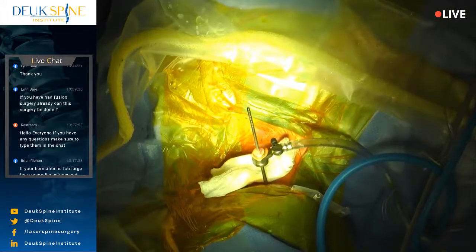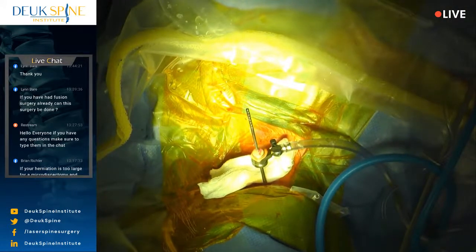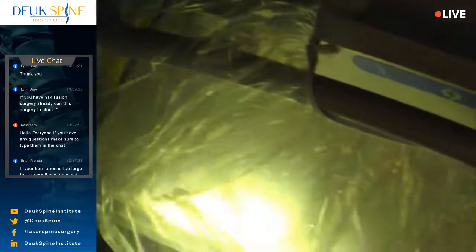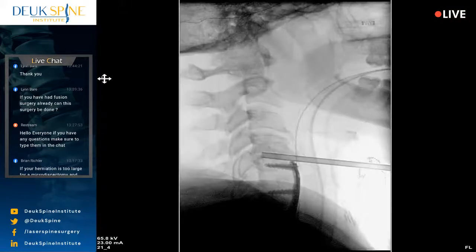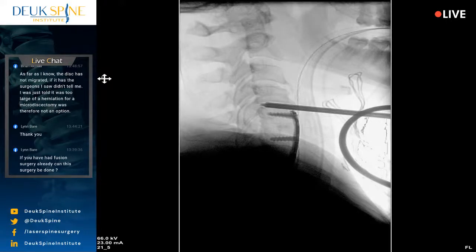Okay, so hopefully you've watched our animation and you understand what we're doing here. We're debriding the annular tear, removing the herniation that's stuck in there, and in this case, we're decompressing the nerve root and spinal cord. So everyone else that does spine surgery does decompression. We do a decompression and the annular debridement. And we do it all without doing open surgery. It's minimally invasive. So there's no need to fuse or put in metal discs or anything. We're done with this disc. We're going to go to the next one up.